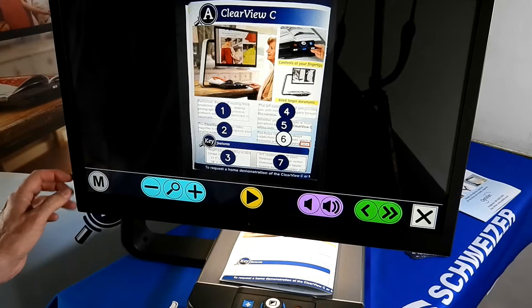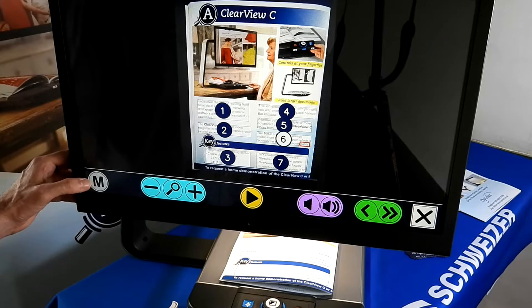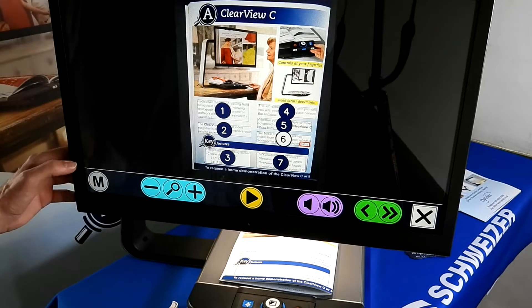The last button on the left-hand side, the M, is for menu. This allows us to go in and change voices or languages, etc.